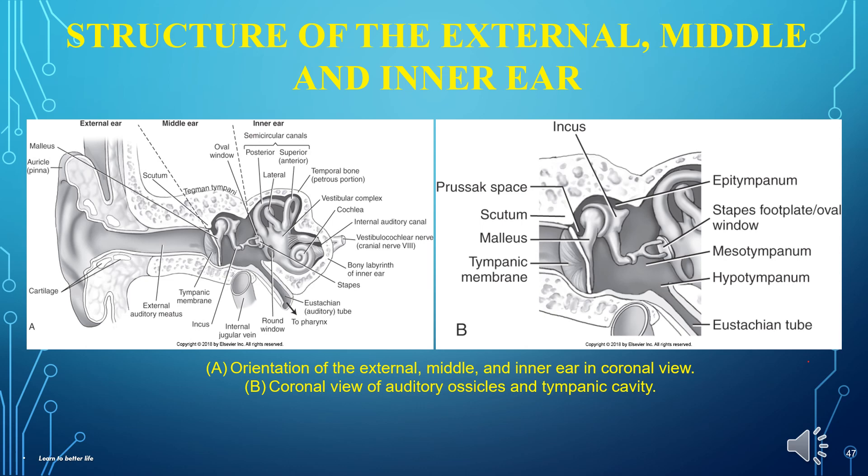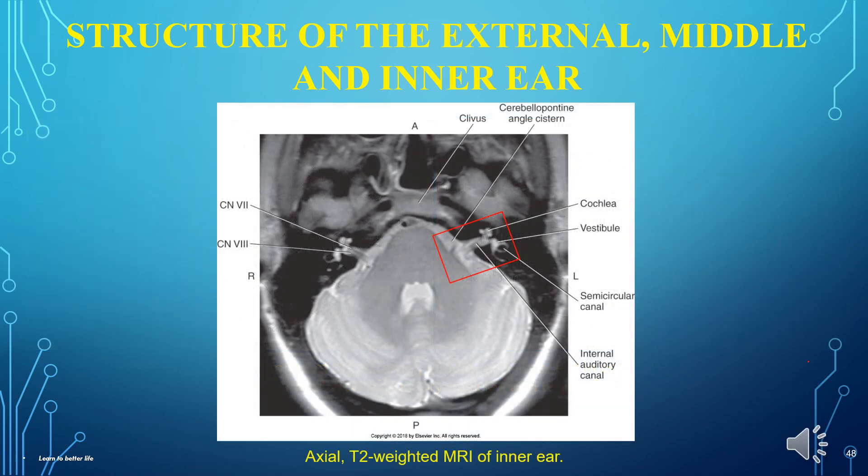This is the axial CT of the temporal bone with foramen lacerum, jugular foramen, and carotid canal. These two images portray the details of the external, middle, and inner ear. A is the orientation of the external, middle, and inner ear in coronal view. B is the coronal view of auditory ossicles and tympanic cavity. Also shown is the axial T2-weighted MRI of the inner ear. Please note the sagittal view of the IAC — because the IAC is tilted, when you scan you have to tilt the box or focus to obtain the true sagittal view of the IAC.